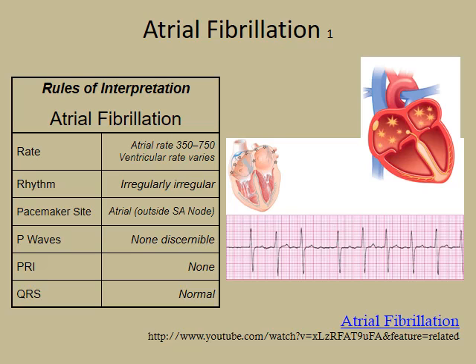0.12 to what am I talking about? Crazy man? No, that's the PR interval. QRS complex is less than 3 little boxes, or 0.12. Whole lot of shaking going on. Irregular is A-Fib.